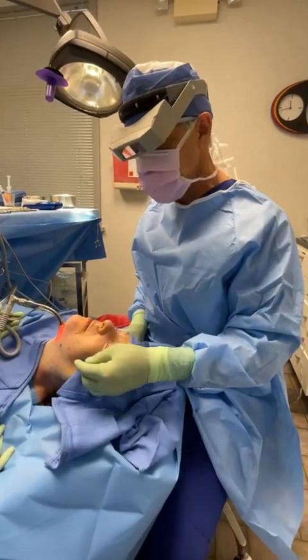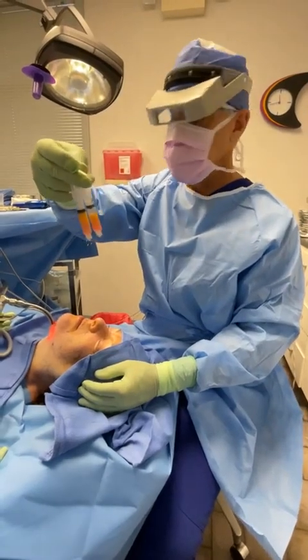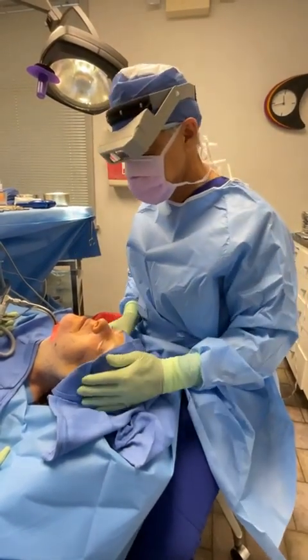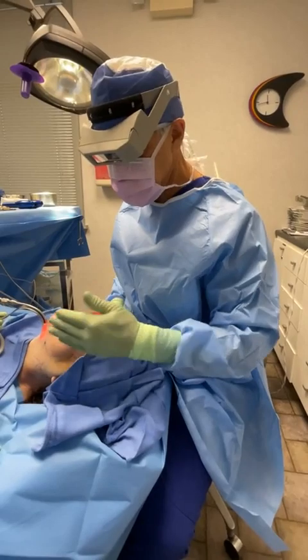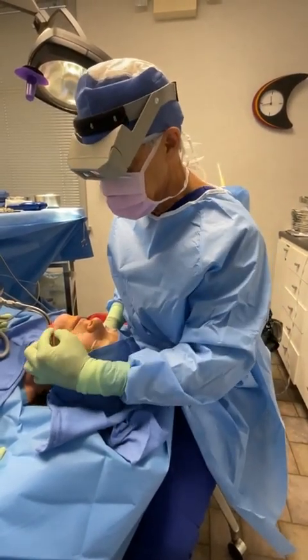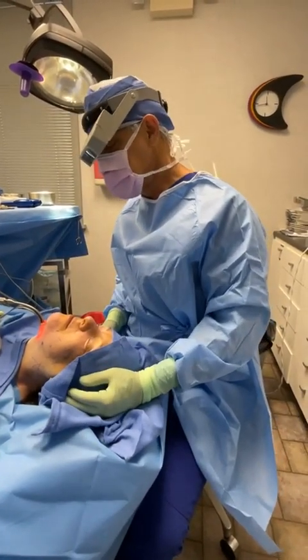So it's nice to remove fat from areas you don't want it and put it in areas where you could use it. This is the fat I took out, and after it's separated from the numbing fluid, I'll put that fat back in a different place — to the inside of that smile line, which will help raise it up. It's like a filler, if you will, and probably a little bit in the pre-jowl notch, which is that indentation often seen in front of the jowls.